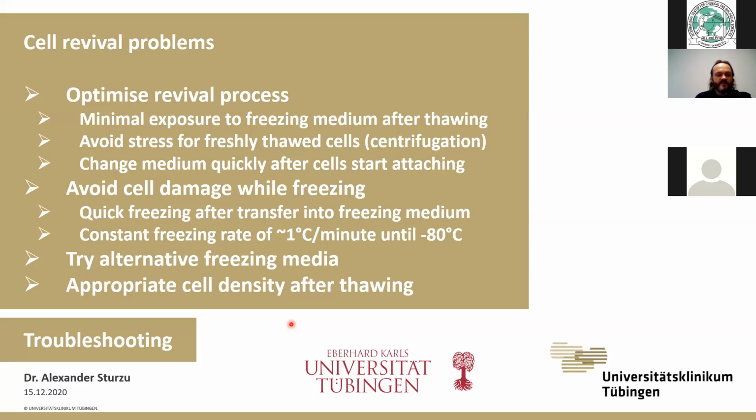Now, the next point, if you still have problems, then maybe your cells did not take offense at the thawing, but your cells got damaged while you were freezing them. I have already mentioned that you should minimize the exposure to the freezing medium while the cells are still metabolically active. So as soon as you transfer the cells into the freezing medium, you should start your cooling and freezing rate. You should quickly go, as soon as you add the freezing medium, on ice, and then quickly go in the freezer for a half hour, 1 hour, and then quickly go into the -80 freezer from there.